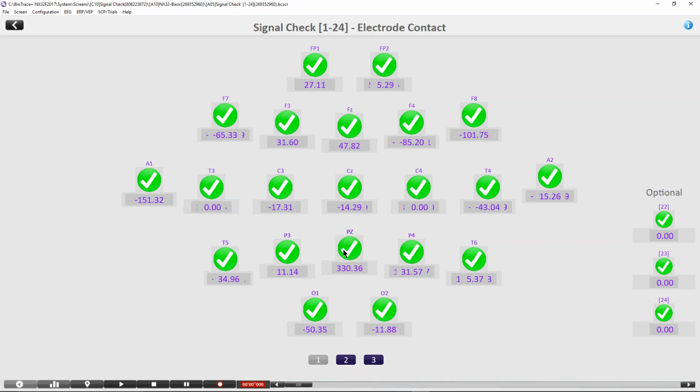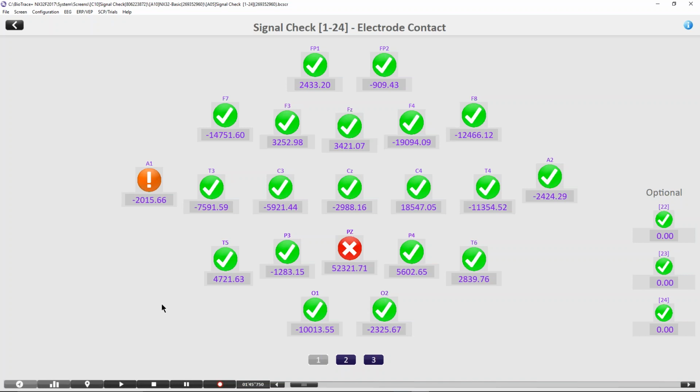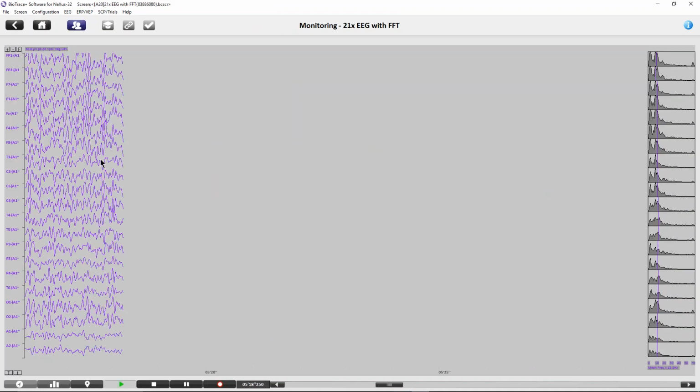And even though at the very beginning it had a good connection, it just kind of changed from a good connection to a bad connection and then no connection at all. So if you see that in your recording and you're seeing that you have a 0 connection here, how do you deal with that? How do you even figure out that you have that?